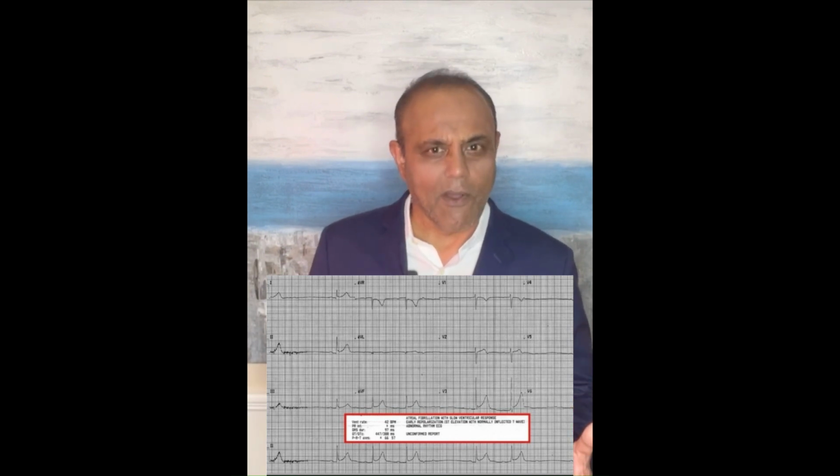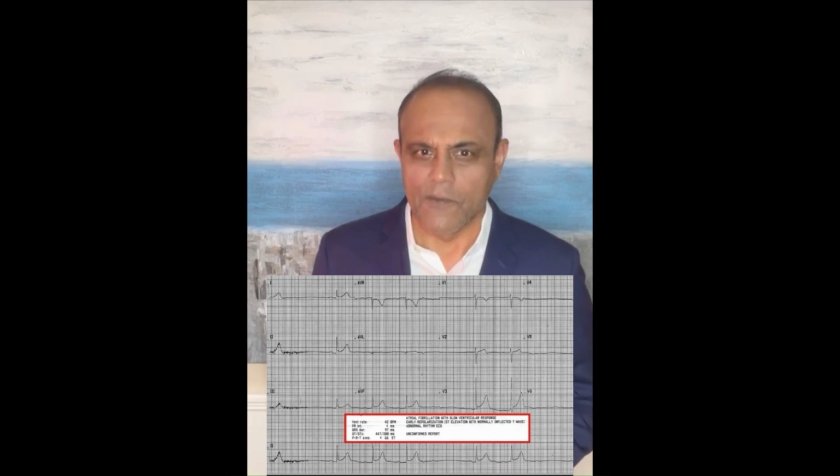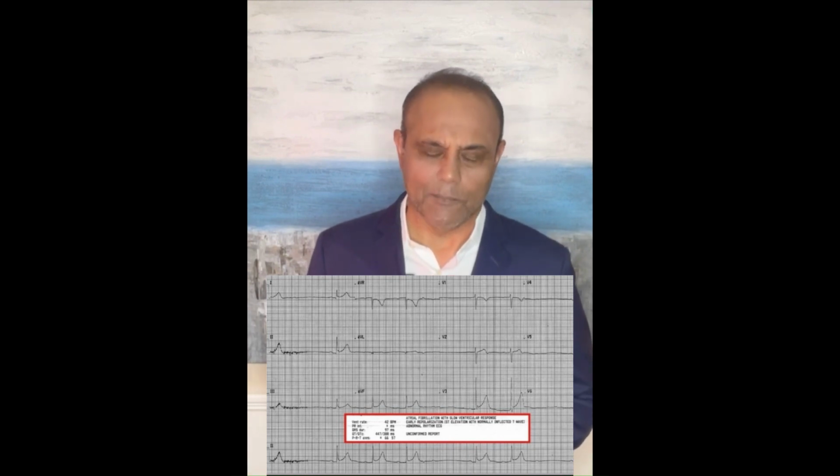So, what went wrong? Well, the physician relied on the ECG's machine interpretation of Afib and missed the diagnosis of a second-degree type 1 heart block.